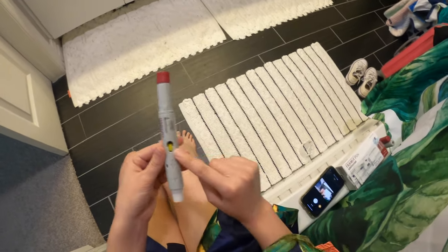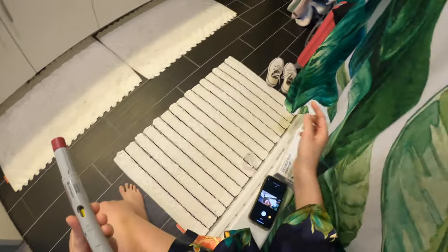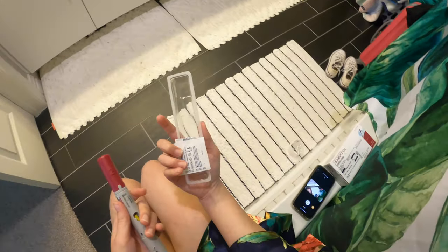All right, and I'm done. The little yellow indicator came out. I'll just put the caps back on and throw these away in my kitchen trash.